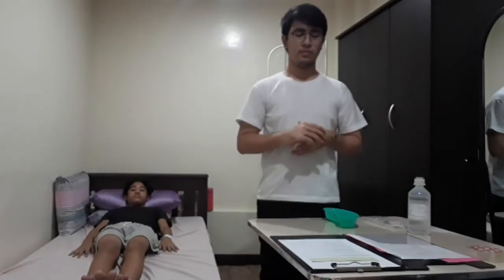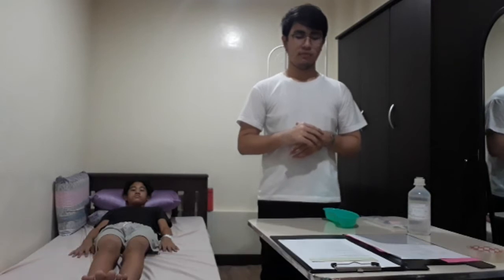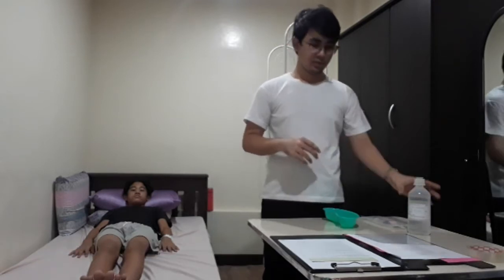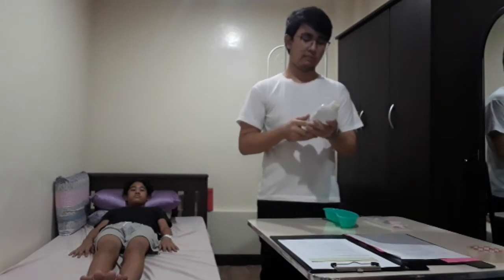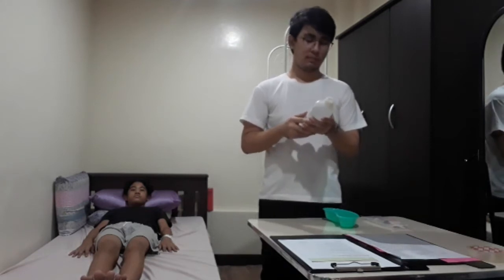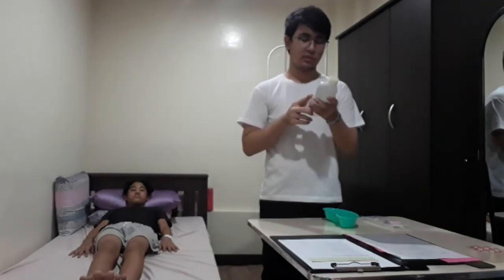After washing our hands, we will now check the label and expiration date of the IV bag, then remove the outer wrapper if applicable. So I'll check the expiration on the label. So I see that here it's plain normal saline solution. Then the expiration date is October 2023.